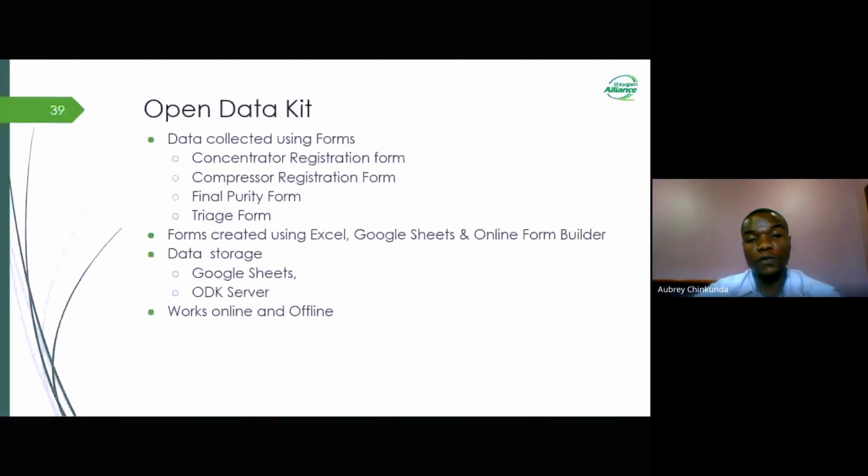So moving on, as I mentioned, you might need to create your own forms. You can create the forms using Excel or Google Sheets. If you do not have any knowledge of Excel or Google Sheets, you can use an online form builder that can be found on the website of ODK. It's a pretty straightforward process. You just click and then add in the various input fields that you want to use to collect the data.